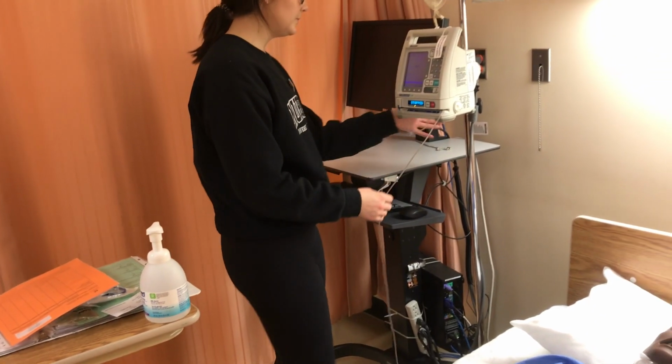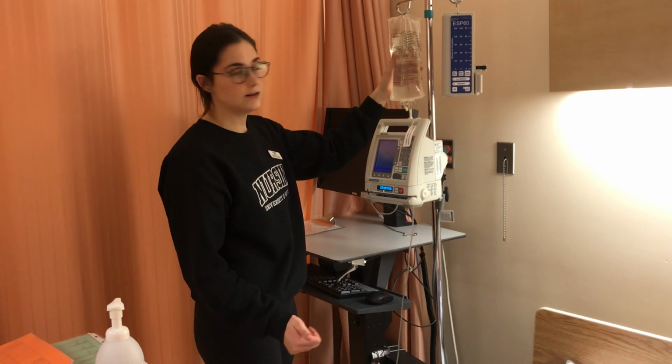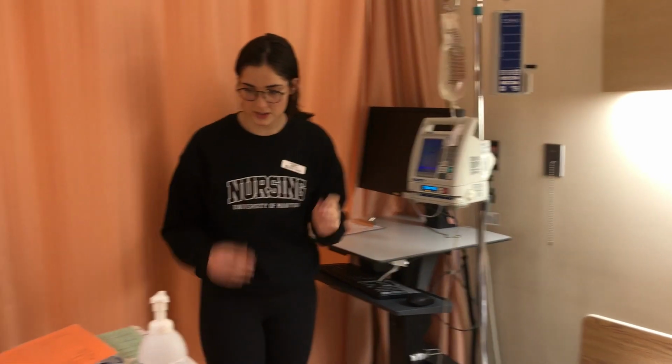Make sure all the clamps are open. Make sure that there's the right medication in here. So this is normal saline. That's perfect. And there's a label on here that got changed today, and it's infusing at the right rate. So that's all good to go.